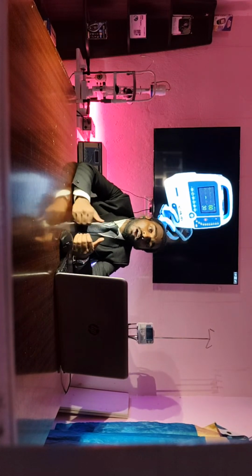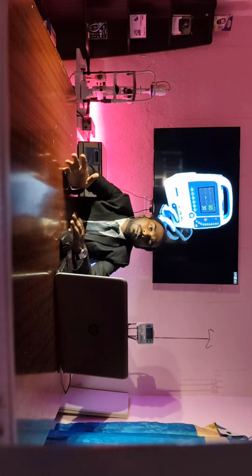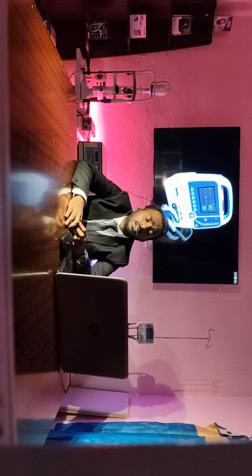CPR, as you all know, is chest compressions, and they can also give air to the patient's body. If CPR is not working at that time, the next step is to go for the defibrillator. Here they will have two paddles, placed at the sternum and apex.